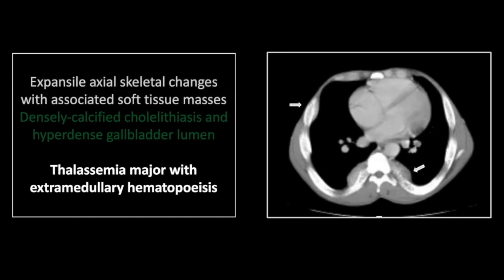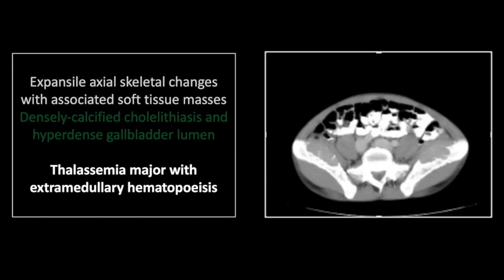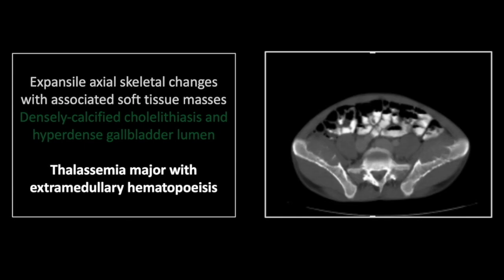You can see the expansile changes of all of the visualized skeletal structures with associated soft tissue masses on the inner aspects of the ribs and in the pelvis, as you'll see lower down. Here on the bone windows, you can see the expansion of the skeletal structures themselves, and again those adjacent soft tissue masses. In the pelvis, you can really see the prominent soft tissue masses and the erosion of the adjacent cortex, and on the bone windows you can appreciate the expansion of the visualized skeletal structures.